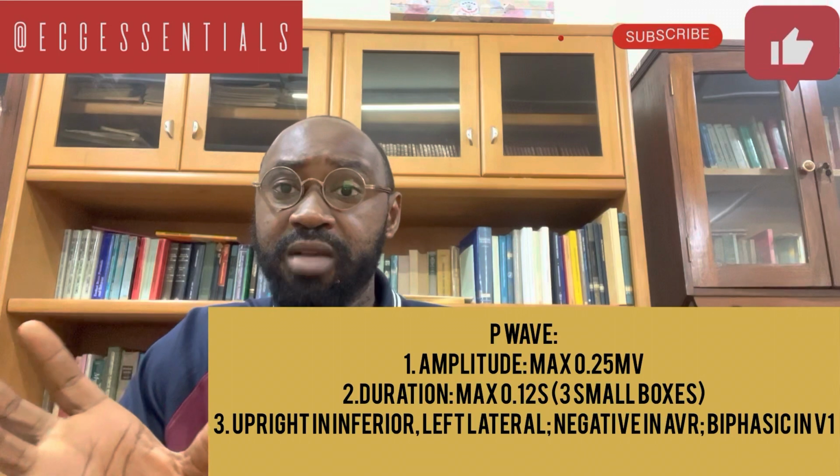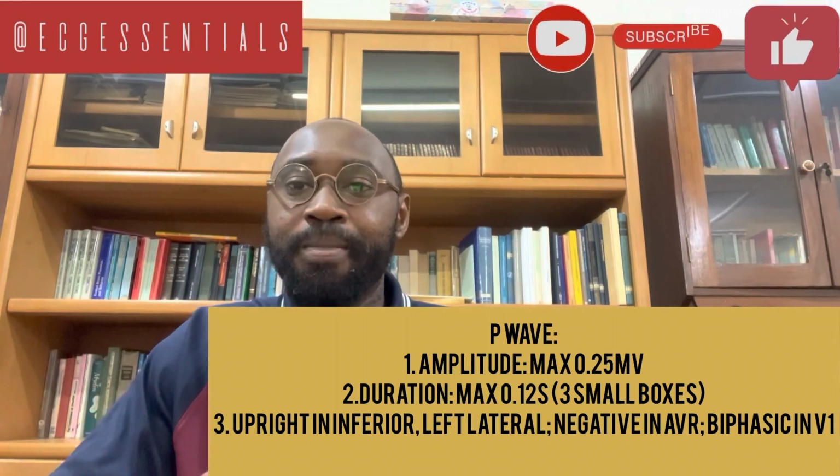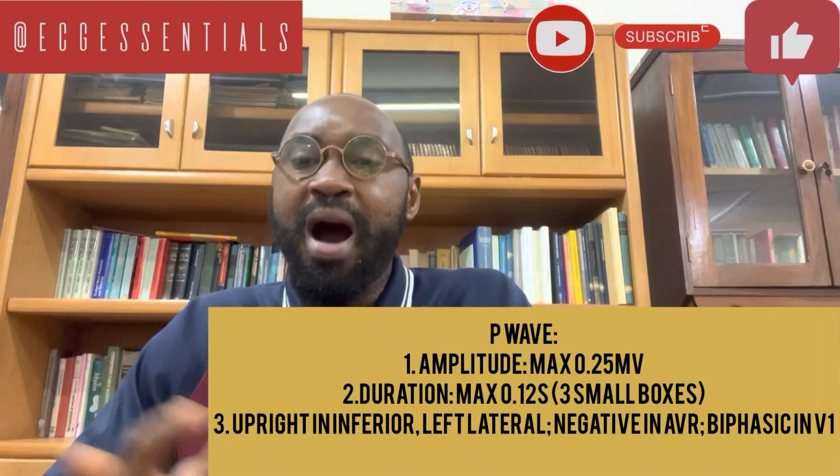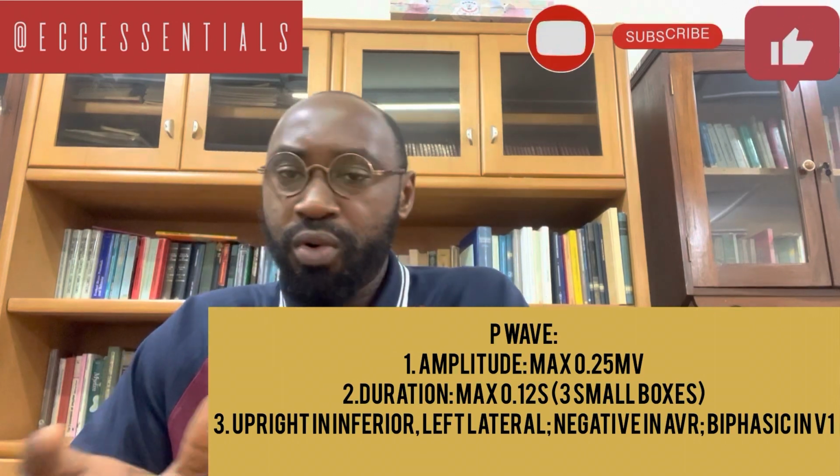We said that the atria themselves are quite small, so they are not able to generate a substantial amount of electrical activity that will be recorded. The P waves are usually even smaller in the precordial leads, usually less than 0.15 millivolts in the precordial leads.